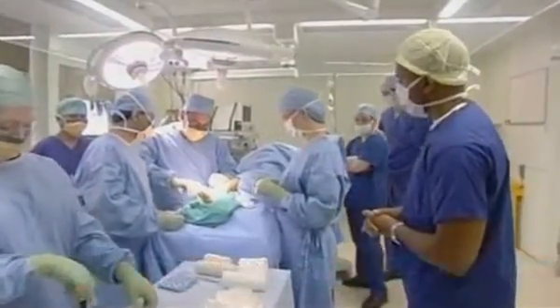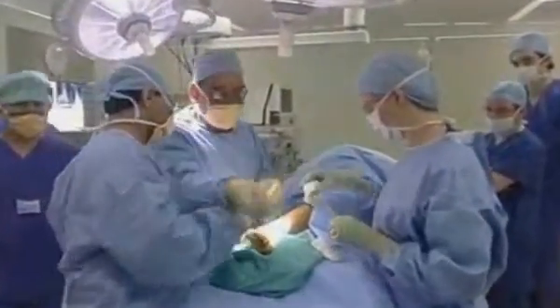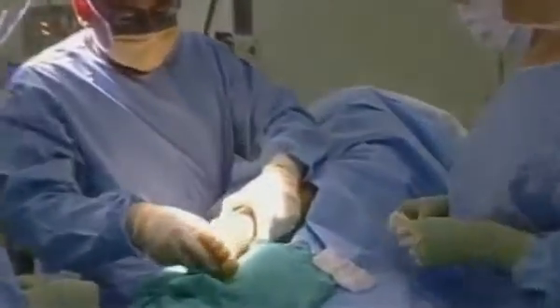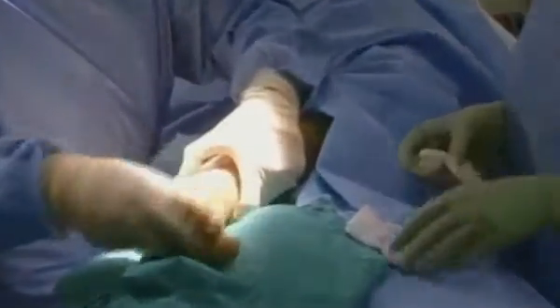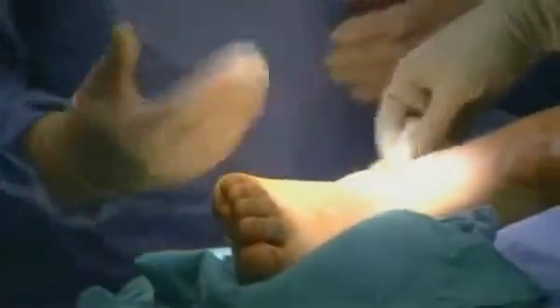We're just putting our last clips in, but basically the operation is done. If I go to show, you can see before, as we moved his ankle, the tendon would jump out. Now, as we move the ankle, the tendon is absolutely fine, and it's nicely locked in place. Now, it's a soft tissue repair. You use staples, sorry. We use staples, yeah. It's the same as using sutures, and you get exactly the same healing. Right, OK, so do carry on. And they're easy to take out.